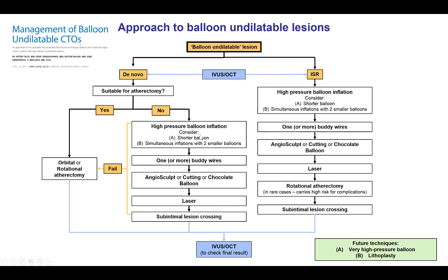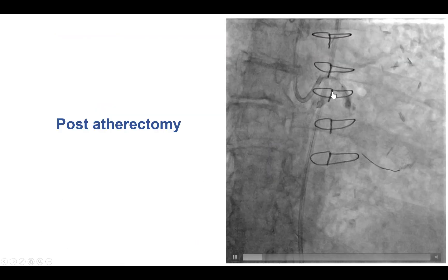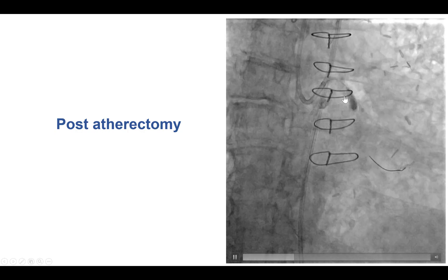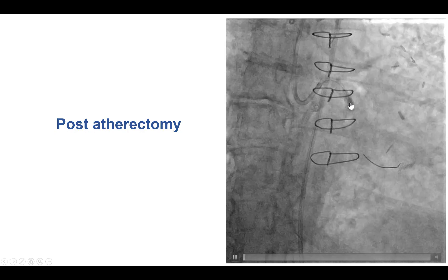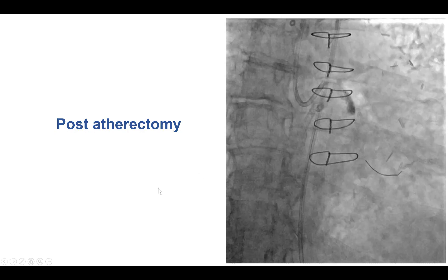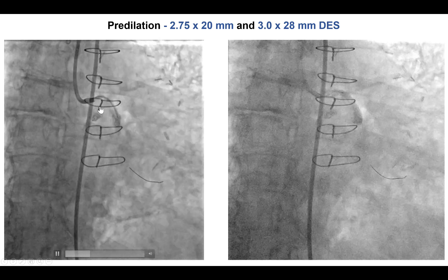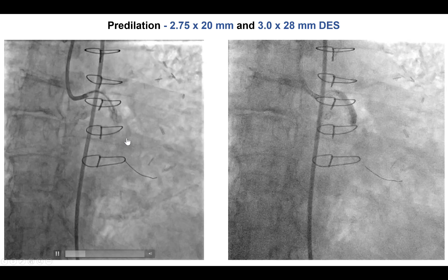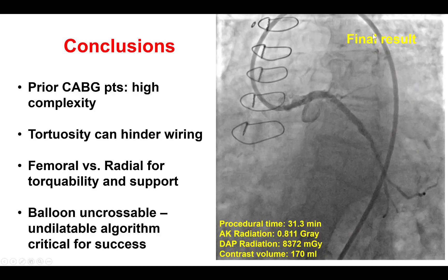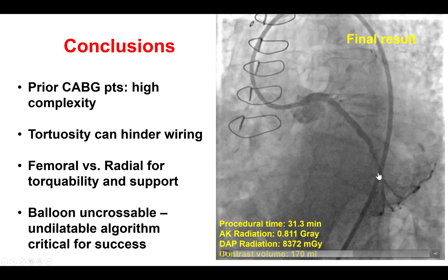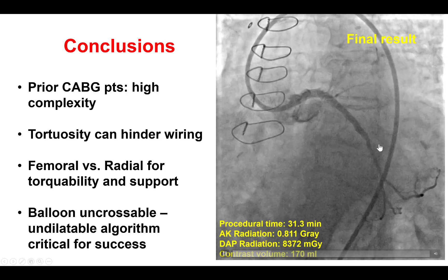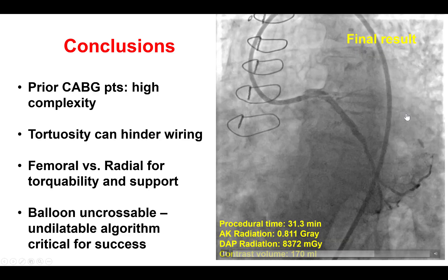In this case we did have balloon rupture, suggesting balloon dilation was unlikely to work. We performed several passes of orbital atherectomy, and after that we were able to expand with a balloon. Following atherectomy we always want to perform balloon angioplasty before placing any stents, just to ensure adequate expansion of the lesion. Stents were then placed all the way from the left main into the second obtuse marginal branch and post-dilated at high pressure, giving a nice final result with TIMI 3 flow in the second obtuse marginal branch.